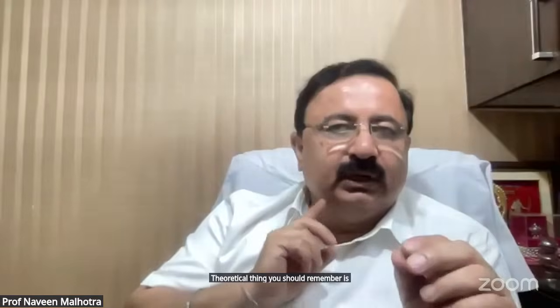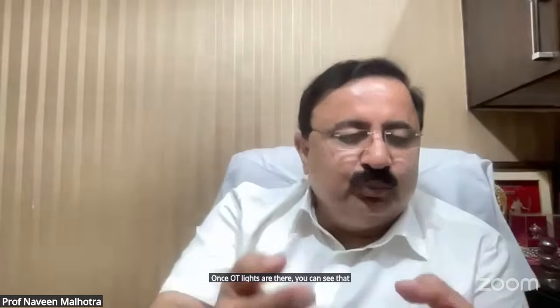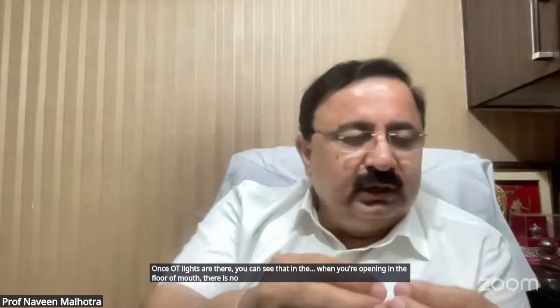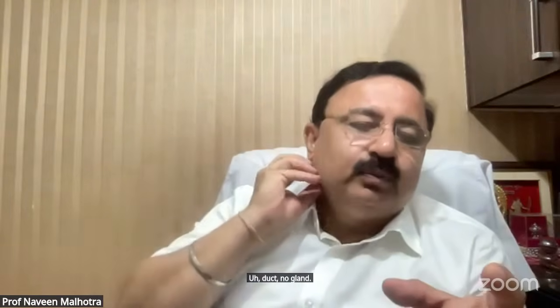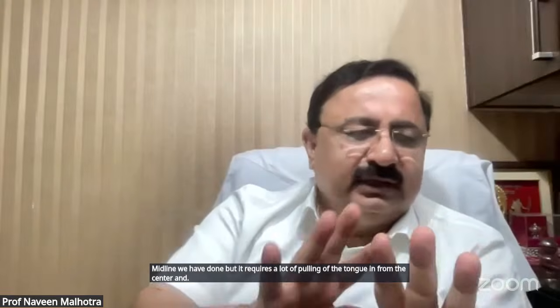The theoretical thing you should remember is to please open the floor of mouth under vision. Once OT lights are there, you can see that when you're opening in the floor of mouth, there is no duct, no gland. If we go more lateral submandibular, then chances of trauma to the submandibular gland can occur. Midline we have done, but it requires a lot of pulling of the tongue from the center, and it is not very comfortable for us to do it. So lateral approach is technically very easy.